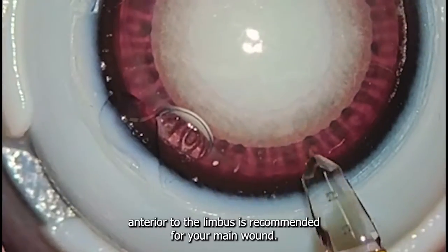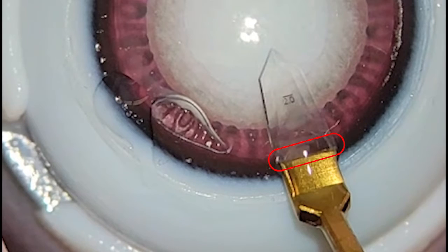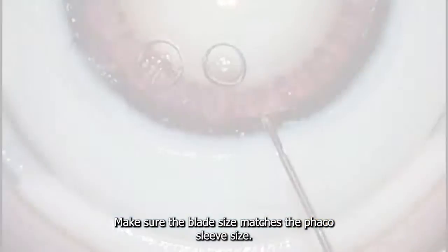A single plane incision, anterior to the limbus, is recommended for your main wound. Make sure the blade size matches the phaco sleeve size.